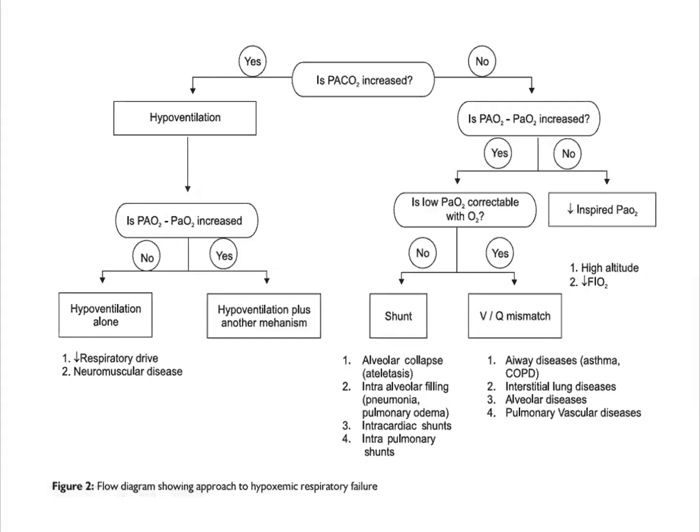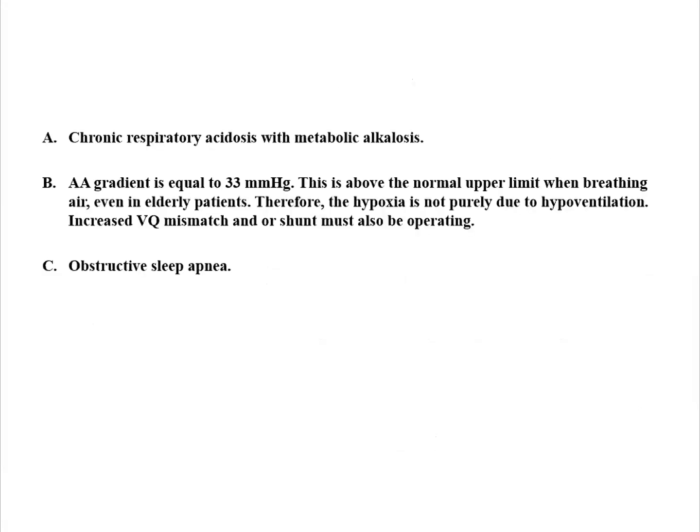In this case, the A-a gradient is 33. Is it normal? What should be the normal A-a gradient?